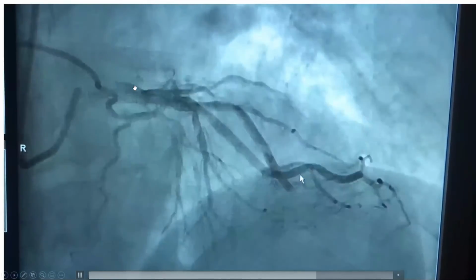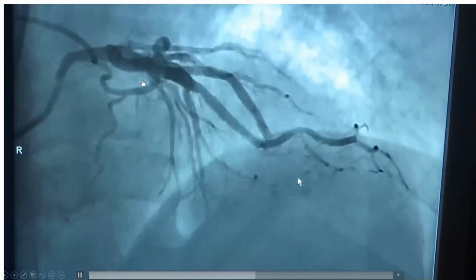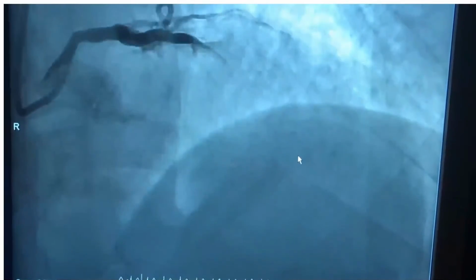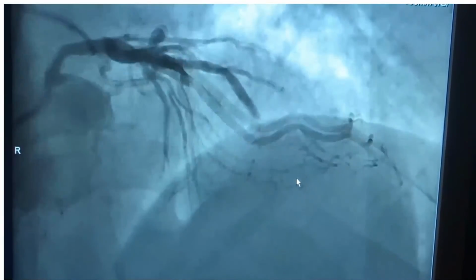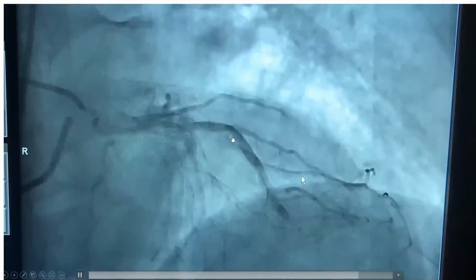If the air bubbles are very proximal and they are causing hemodynamic compromise, then you can suck through your guide, suck forcefully, maybe even deeply engage with your guide and suck forcefully. So those are the two big strategies, depending on whether they are distal or proximal.